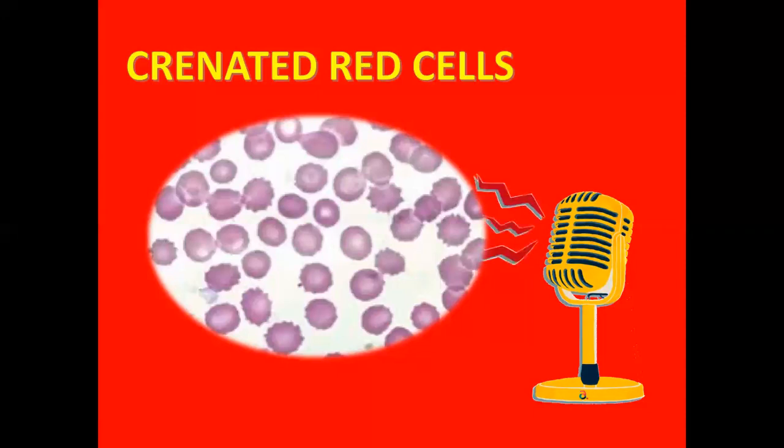And the other one is it can be due to a prolonged sample. So maybe the specimen used for blood smear preparation is several hours old anticoagulated blood. That may also be one of the factors why these red blood cells turn into that type of poikilocyte: prolonged sample storage before blood film preparation. Okay, so that's echinocytes or crenated red blood cells.